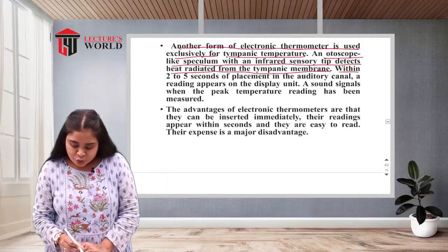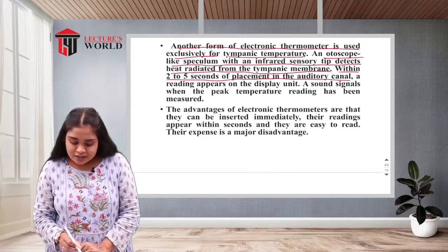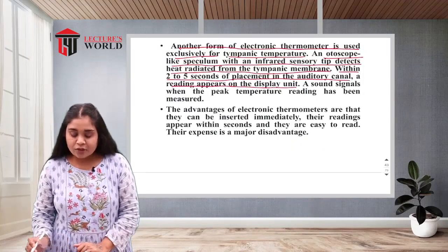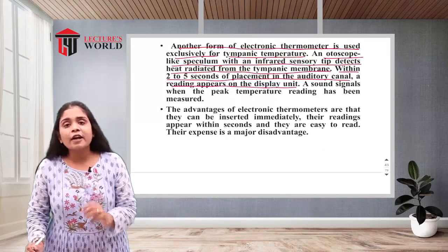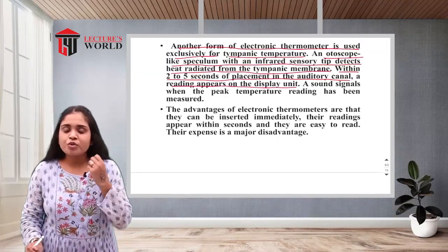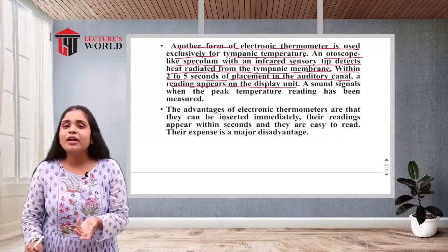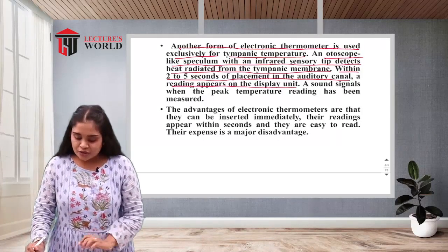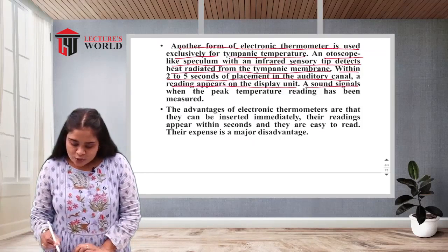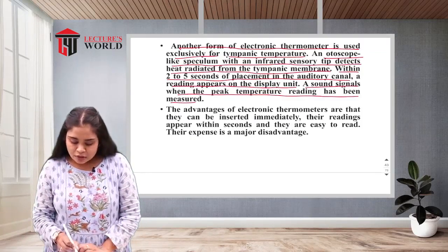Within 2 to 5 seconds of the placement in the auditory canal, a reading appears on the display unit. So it takes only 2 to 5 seconds to know the temperature of the patient. You just insert and wait for 2 to 5 seconds, and you will have a reading of the patient. There is a sound signal when the peak temperature reading has been measured.